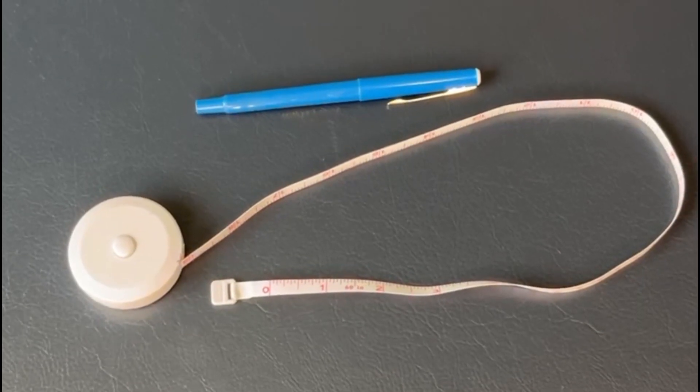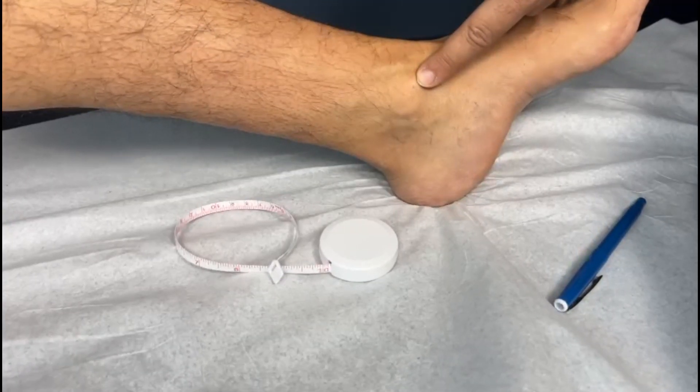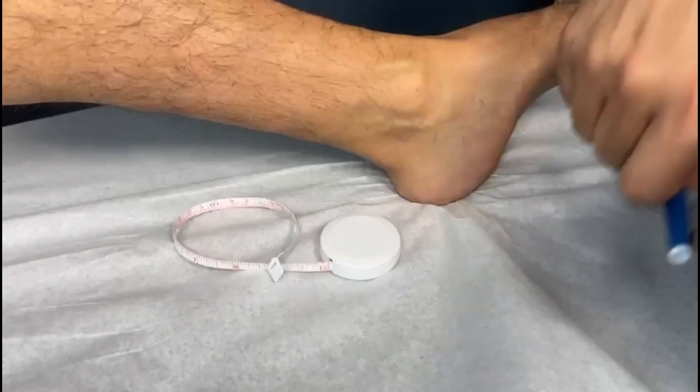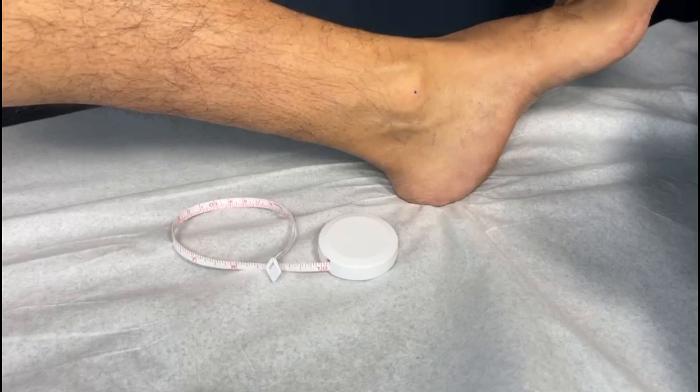To measure for a brace you will need a tailor's measuring tape and a marker. To determine the size of your elastic ankle foot support brace, measure the circumference of your ankle at its widest point and choose the corresponding measurement.